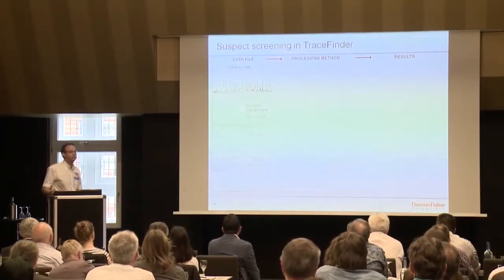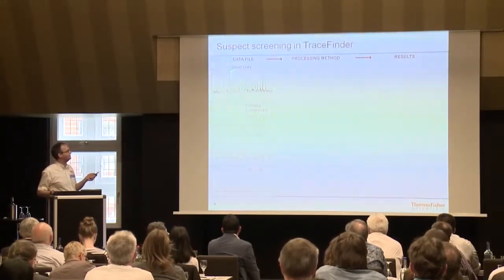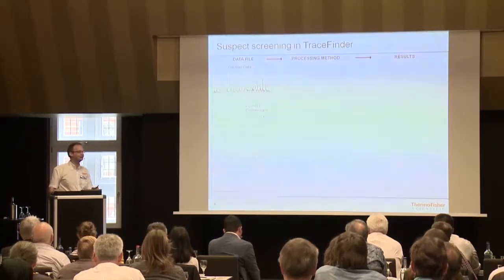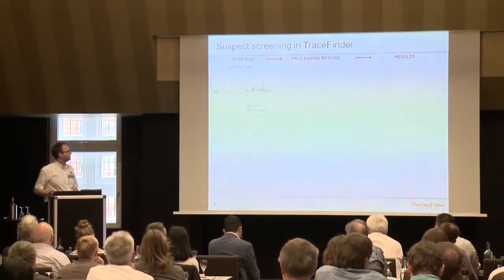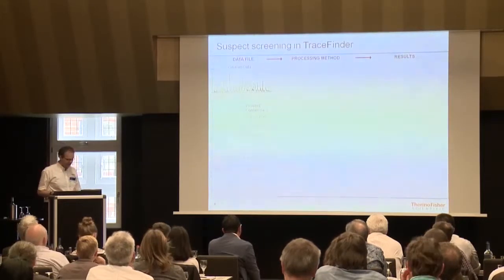Okay, so what is the basis we are running on? We have somehow data, and if you look at that trace, it already looks quite meaningful. In many cases, it's even worse. You just see a baseline at 1E8 or 1E9 counts because you have some background which is just constantly in there. You don't see anything. This button here, okay. So there is a possible contaminant.